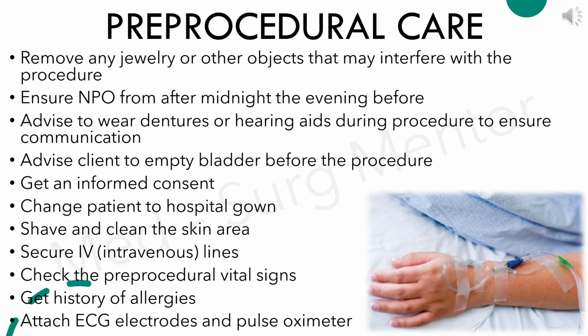Get an informed consent. Change patient to hospital gown. Shave and clean the skin area using disinfectant solution. Secure intravenous lines. Check the pre-procedural vital signs. Get history of allergies. And attach ECG electrodes and pulse oximeter.